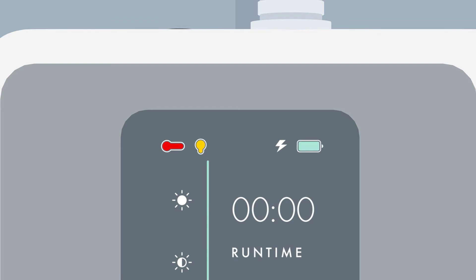Battery Status and Low Battery Alert displays the current battery level. When the battery is low, the battery icon will flash and sound an information signal. Charge the battery immediately when the low battery warning flashes. If the device has not been used for a long time, make sure the battery is fully charged before use.